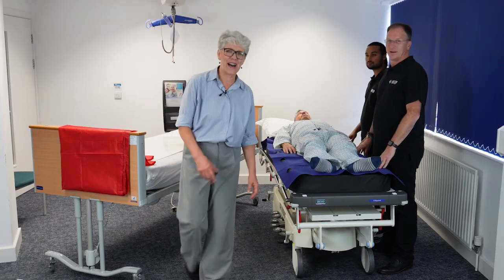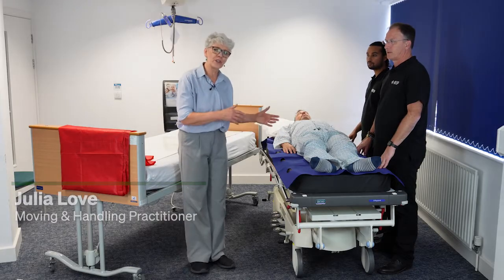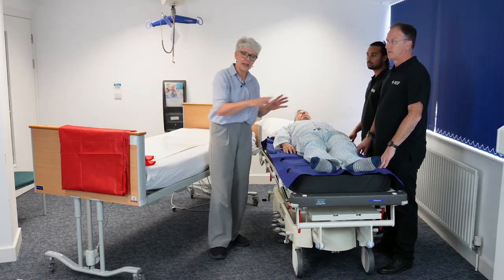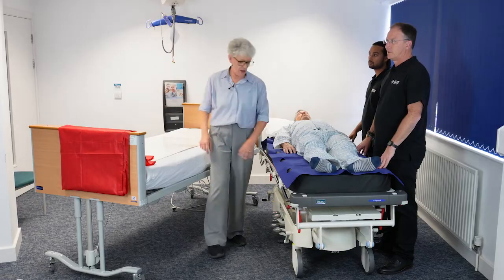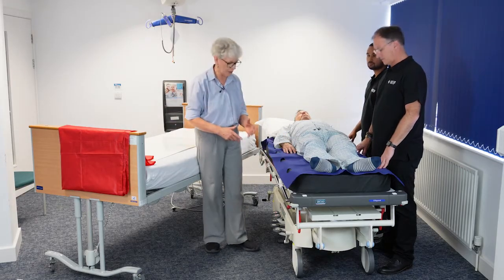Hello, my name is Julia Love and I'm an independent moving and handling practitioner. For this demonstration we're going to look at a trolley to bed transfer. This could also be an operating table to bed transfer — it's all the same.